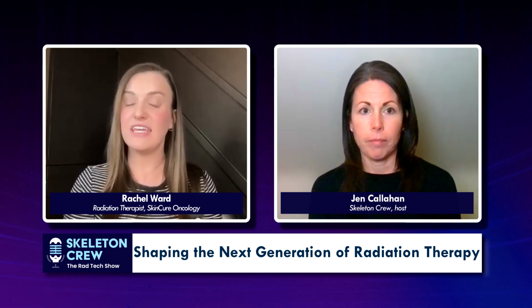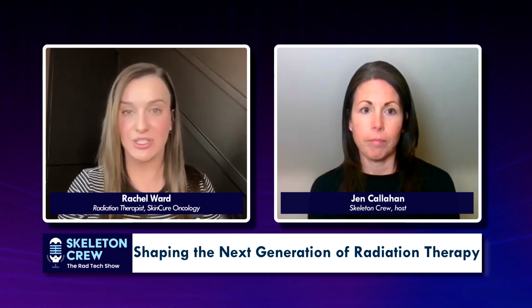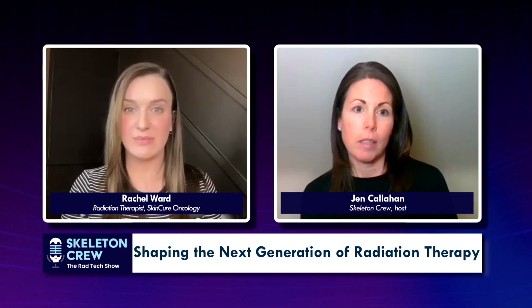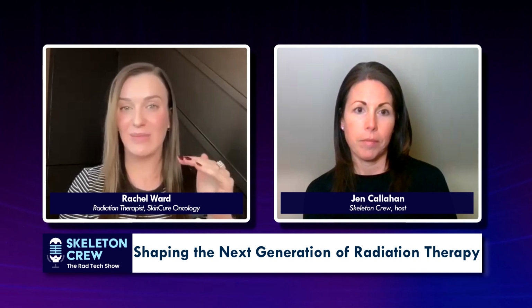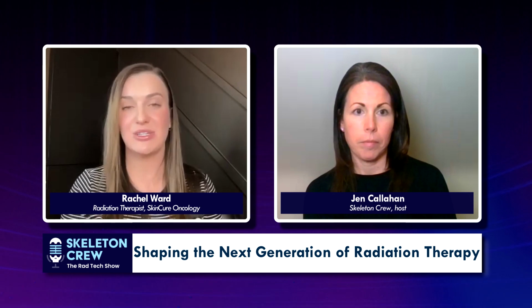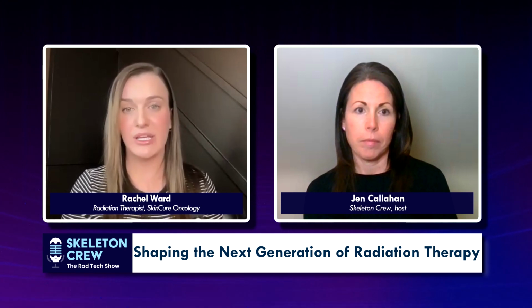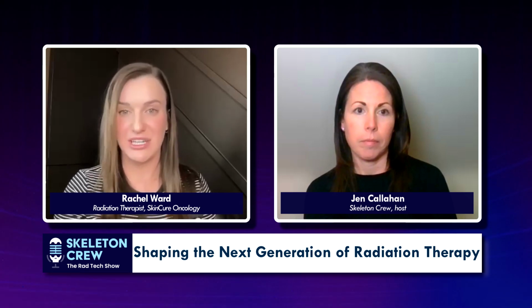But when you're using MV energies, they're penetrating deep into the body. That's what you would utilize for something like a brain tumor or prostate cancer, something that can penetrate through the tissue to reach your targeted area. We're using photon beams. It's a 50, 70, or 100 kV photon beam. If you were to use electrons, they're going to penetrate a little bit deeper. And when you do that, if you want them to be at that top layer of the skin, you have to use something to compensate for that tissue because you want that maximum dose to be delivered at the surface. You have to use something like a bolus to be a tissue compensator to mimic those more superficial energies. So you can use the machines that are in a rad-onc department to treat skin cancers, but they're a lot more powerful than what we need for these early stage non-melanoma skin cancers.